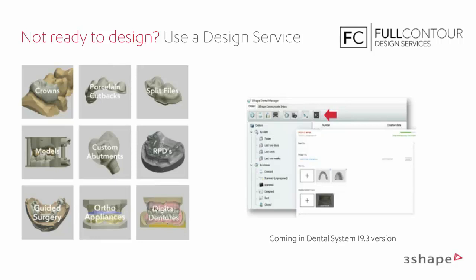The problem is to hit the shades. It's a great question. I know the team have been investigating it, but it's quite hard to hit the actual shades correctly, also depending on how you visualize on the monitor. It makes it hard to adjust it very freely. But it is basically high on the list from the Smile Design team already.